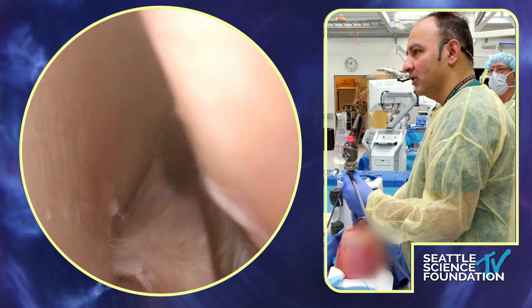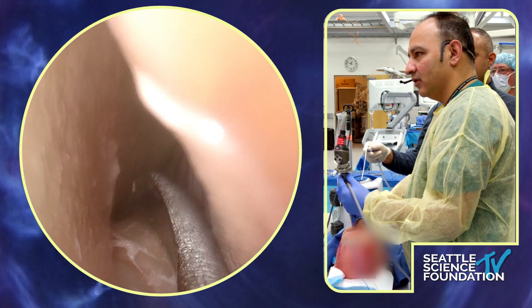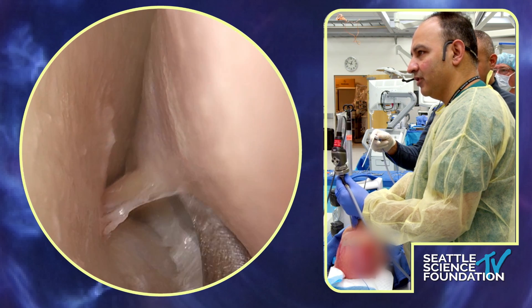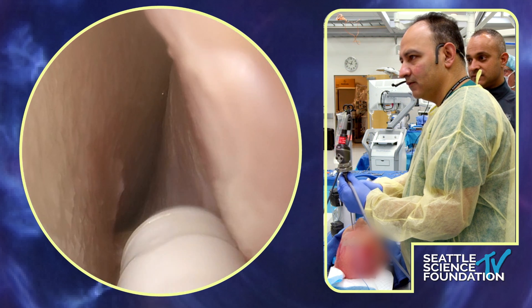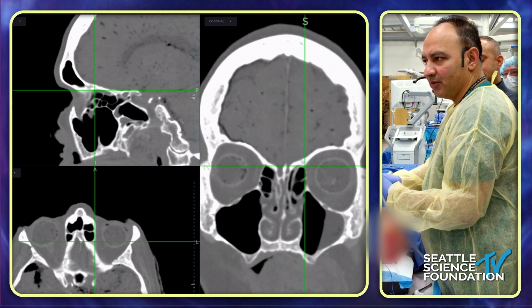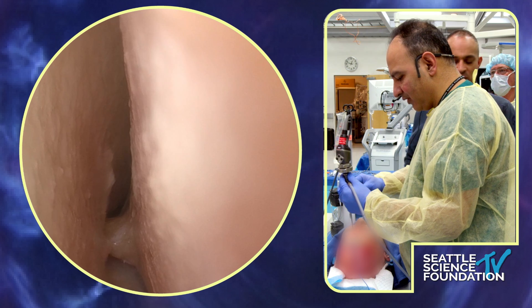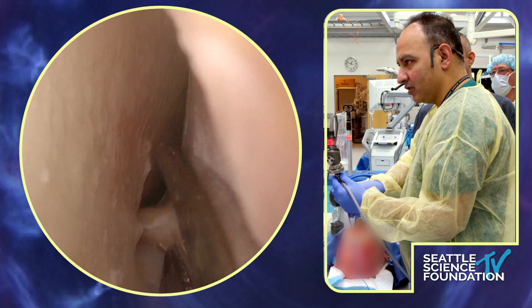Oh, there we go — is that it right there? Now we've got a good plane there. It looks like we found it. Let's go with the navigation and look at what we've got. Sure enough, that's just where we saw it on the endoscopic view — right where that teardrop sign was. We're going to cut it for fun and then see if we can find the posterior one too.